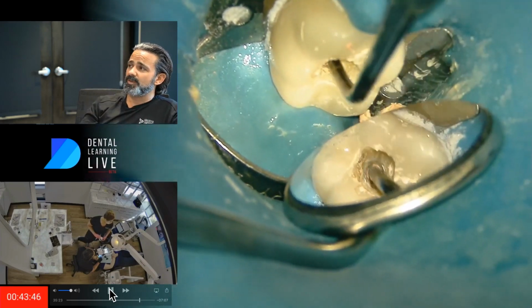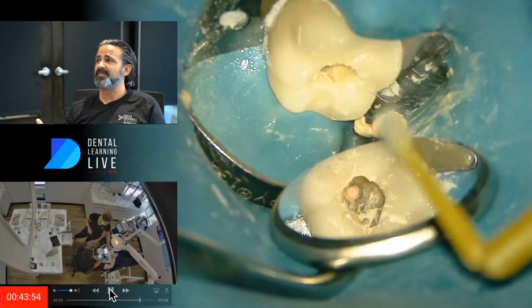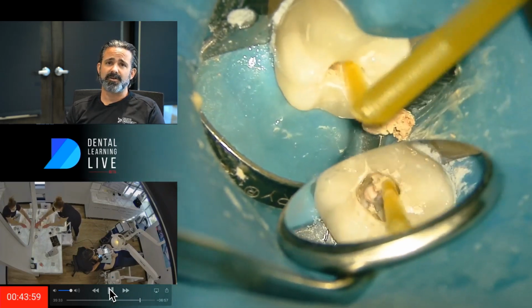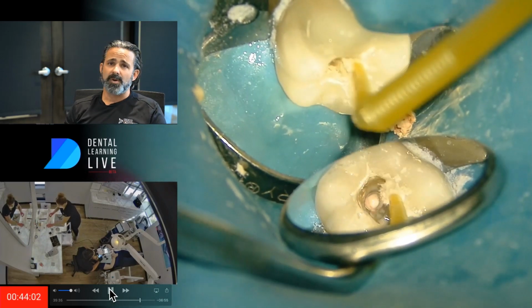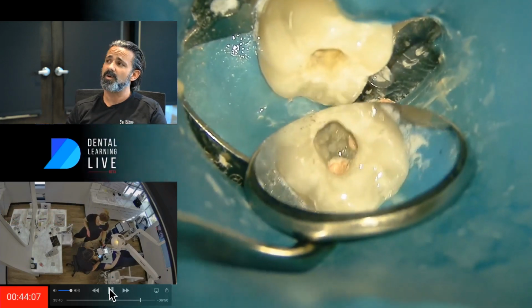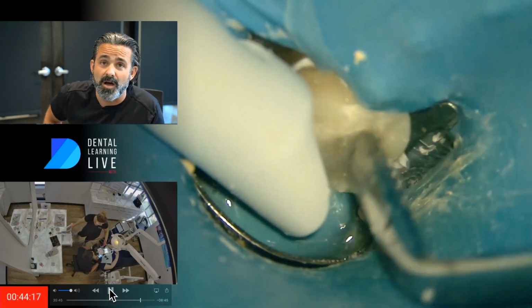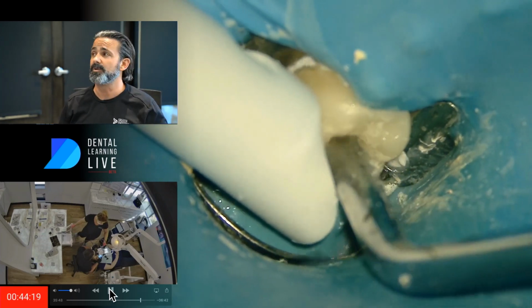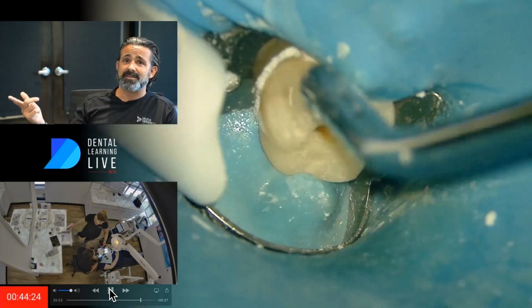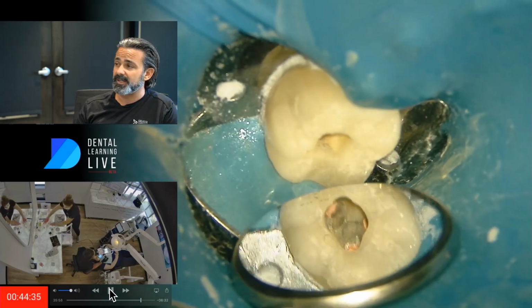But again, in thoughts of using the GentleWave and knowing what it can do when you have defective dental materials, such as defective sealer set under a crown because it's worn out, or composite walls, whatever, I'll be able to make clinical decisions along the way on what I report back to my dentist. But when it goes well, I'm really confident that what's there is good to go. And that's where I am here. And again, I keep saying this, but I'm not the first time into the same crown. Well, I know for sure it's the second time into the same crown.